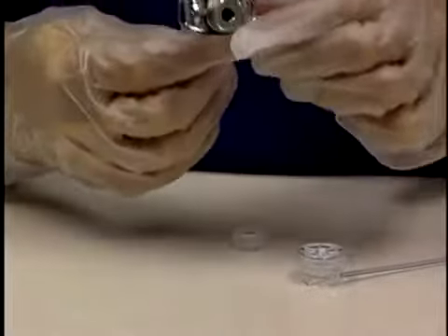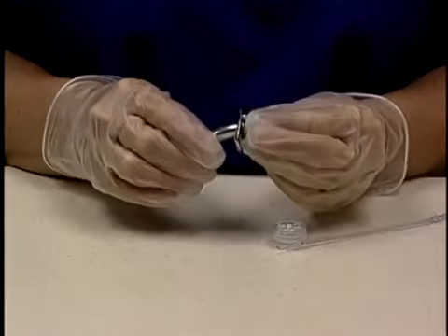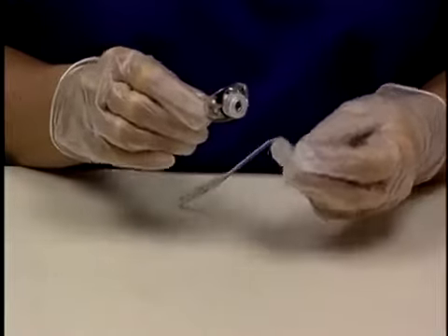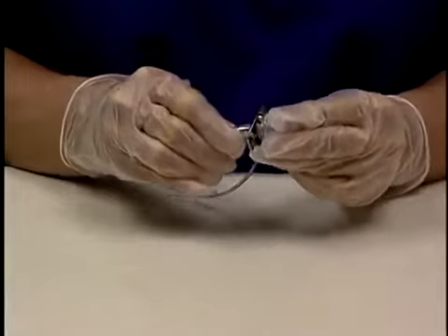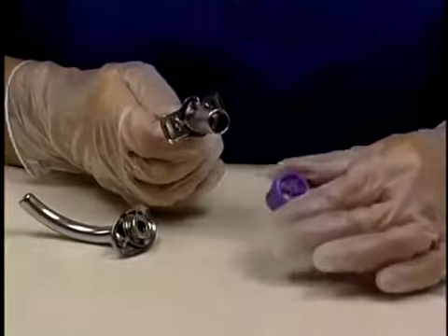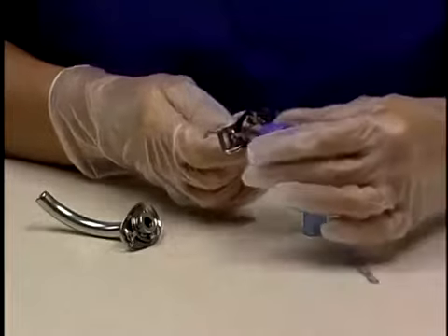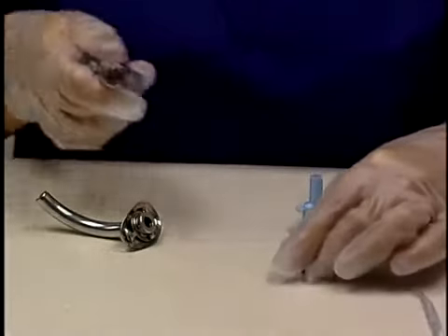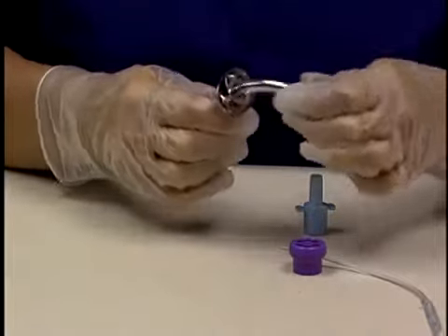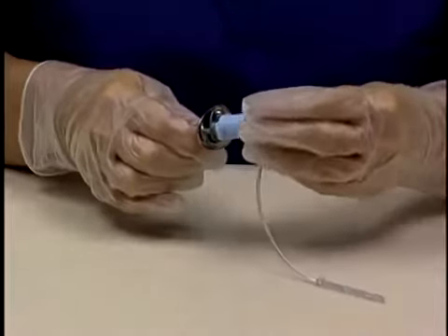For patients using metal tracheostomy tubes, the PMV 2020 speaking valve and adapter may be used with the appropriate tubes as discussed earlier. Please see the PMV 2020 instruction booklet that comes packaged with each valve for further information. Some manufacturers of metal tubes offer an optional 15-millimeter hub for the inner cannula, which will allow for connection of the valve. The 15-millimeter hub inner cannula may be ordered from the manufacturer or distributor. Another option is a plastic endotracheal tube adapter sized to fit a low-profile metal tracheostomy tube to create a 15-millimeter hub.